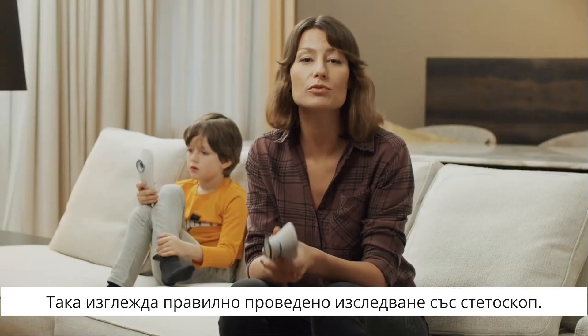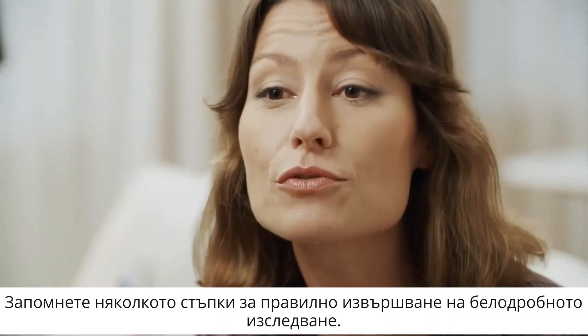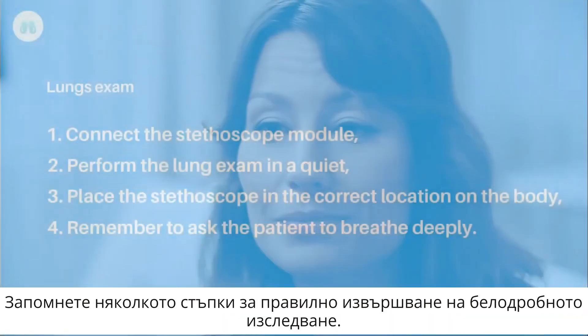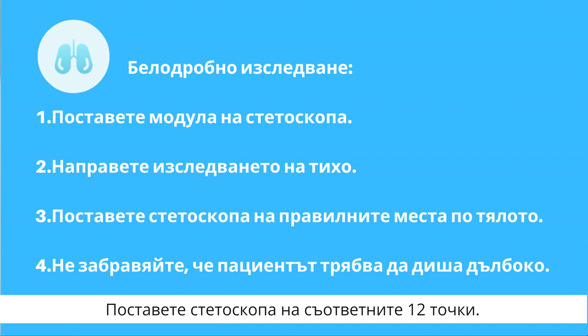This is what a properly performed stethoscope exam looks like. Keep in mind these few points to ensure you properly performed the lung exam: perform it in a quiet environment, place the stethoscope in the correct location, and remember to ask the patient to breathe deeply.